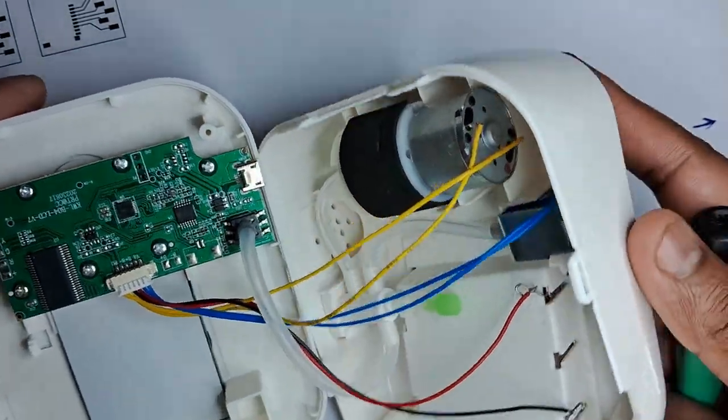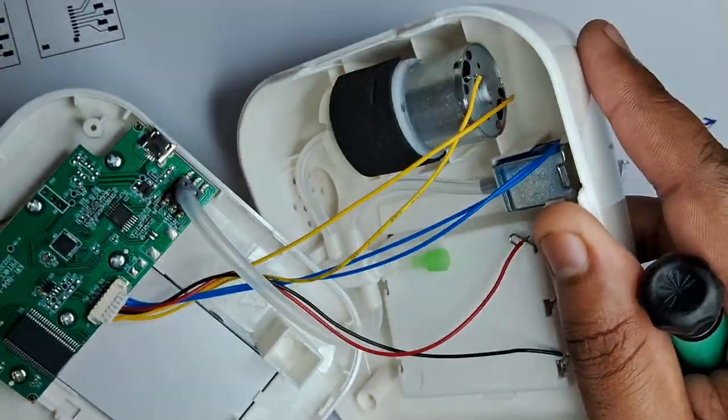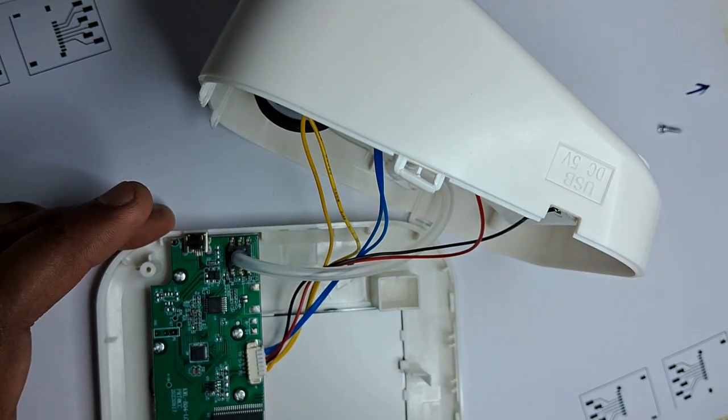What is there in this guy? What is there in this guy? So in this, we will open this up.